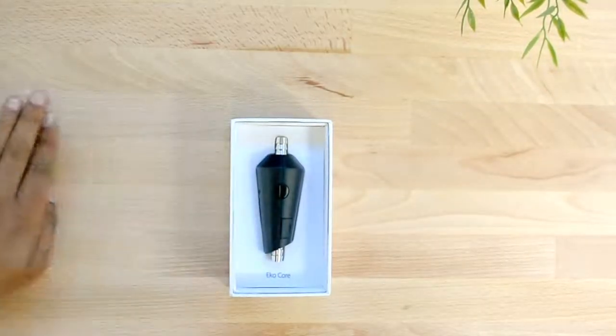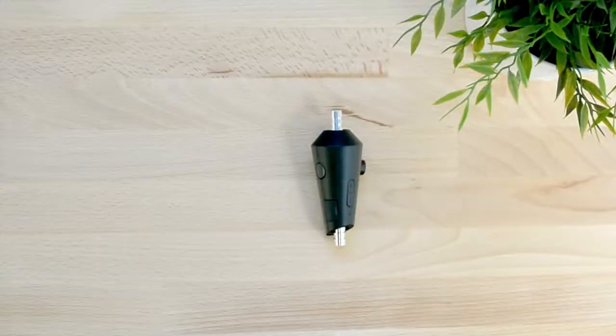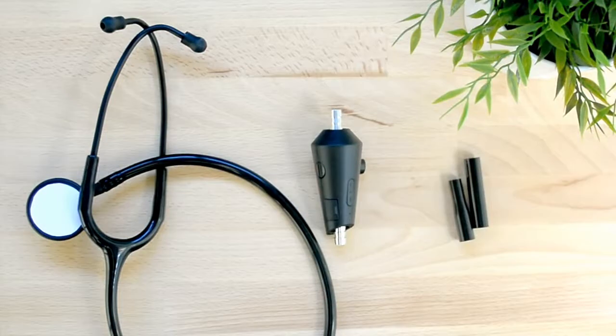Now let's connect your Eko Core attachment to an analog stethoscope. We will start by attaching the Eko Core to a small tube stethoscope and then show you how it connects to a large tube stethoscope. We have included a large and small adapter to fit stethoscopes of any tubing size.